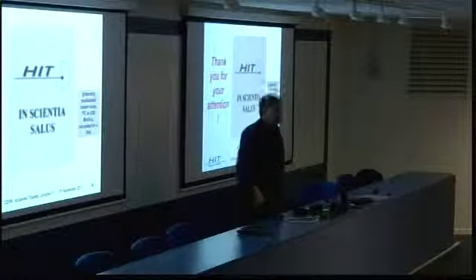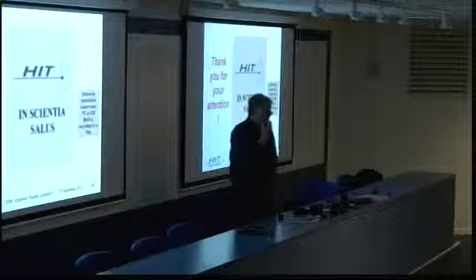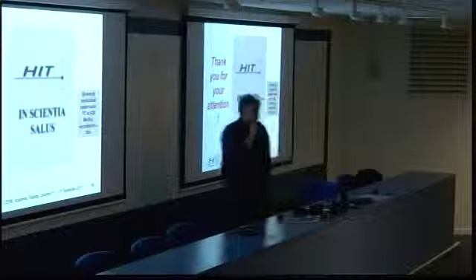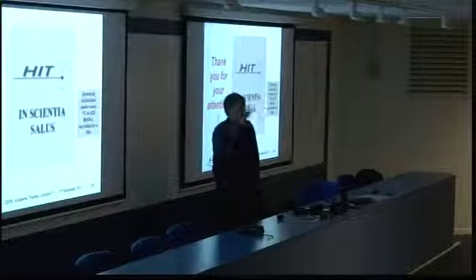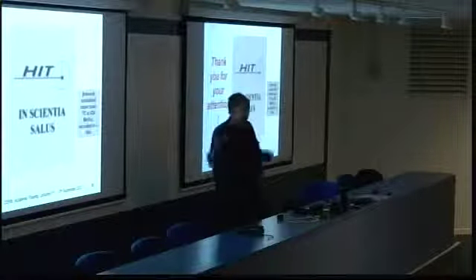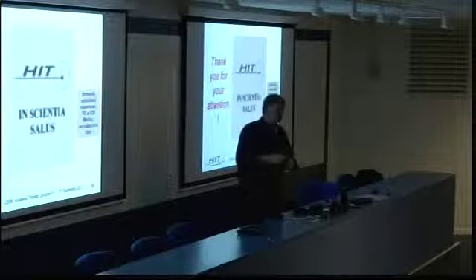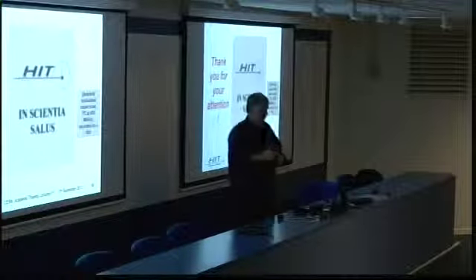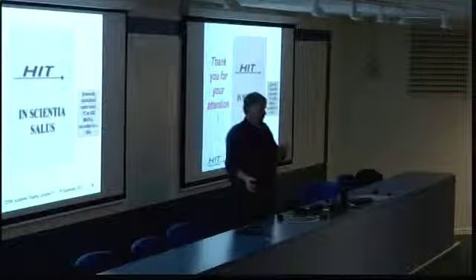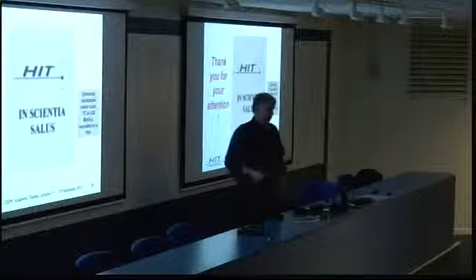That's a good question. I do not really have an answer for that, but I estimate some problems which may occur. A little bit the same story is at Boston, where you have the last bending magnet which has 135 degrees. So a very long magnet, only a dipole magnet. So I think they will have problems with the beam optics. It's not easy to bring in the beam over such a long beam path without having quadrupoles to again focus the beam. This is one story.